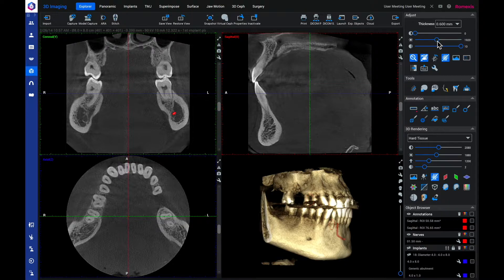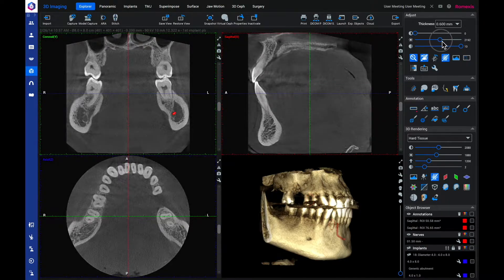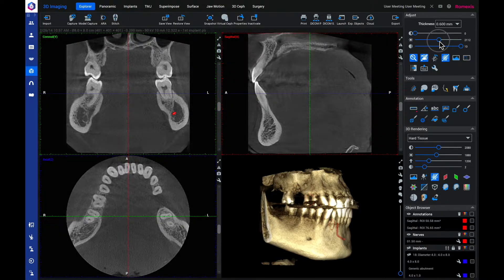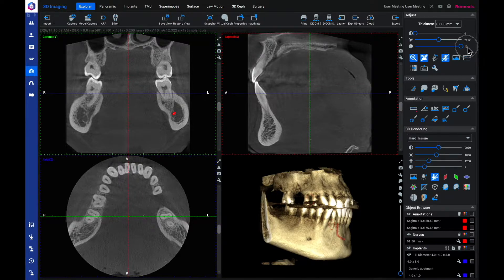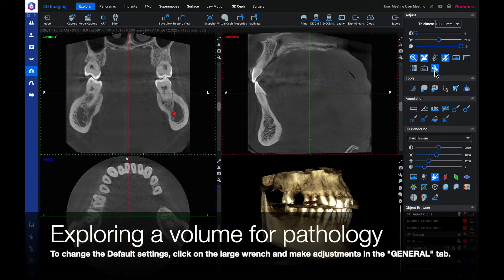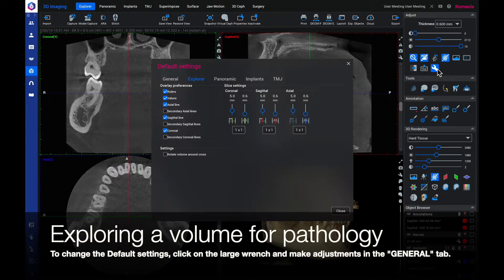Your default settings should have the contrast all the way to the left, the brightness in the middle, and the sharpness all the way to the right. To change the default settings, click on the large wrench and make adjustments in the general tab.